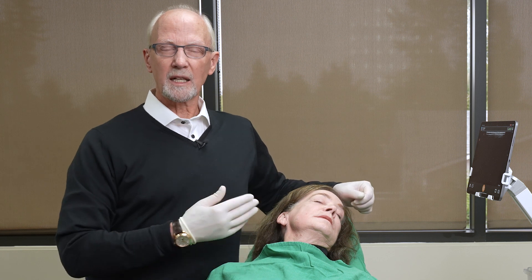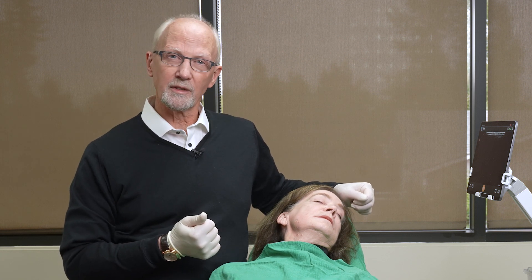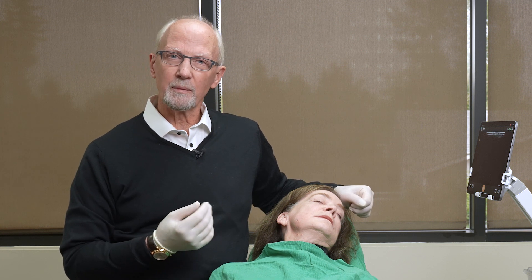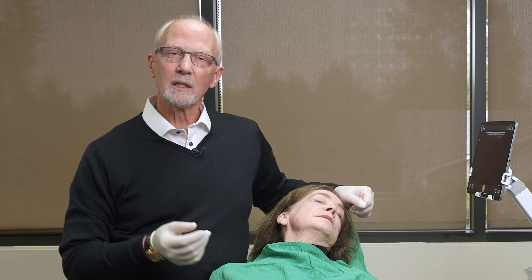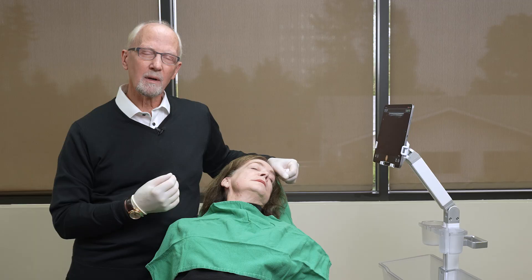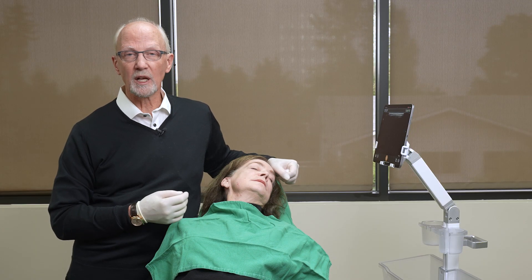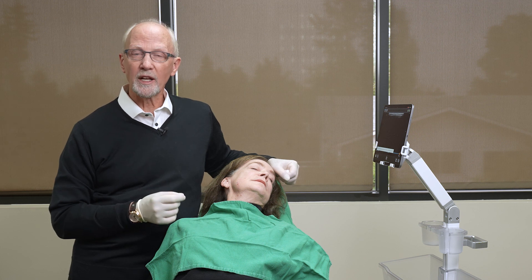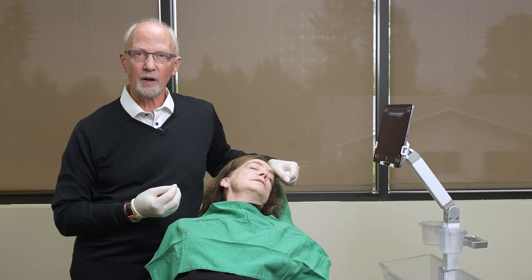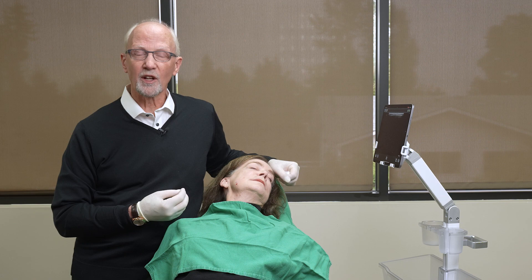So now we've started our second stage of treatment. We've tried our intervention in terms of aspiration, which we have done before. We've injected it with hyaluronidase. Today we've aspirated but been unable to aspirate any material, so we've injected directly into this area with triamcinolone acetonide — 0.2 cc's of 20 milligrams per mil using a 22 gauge needle. So there we have it: ultrasound guided intervention for an area below the masseter which develops subsequent to filler injection.